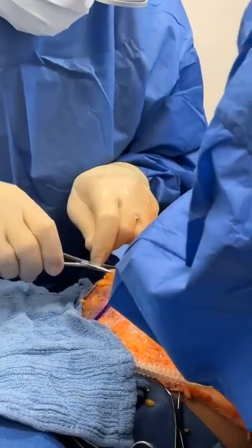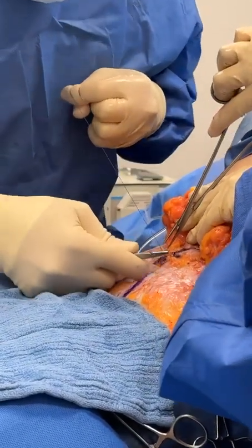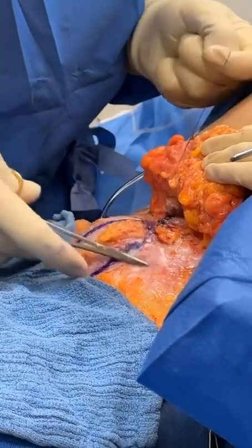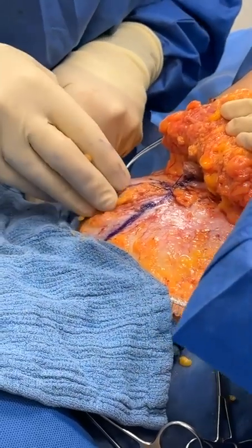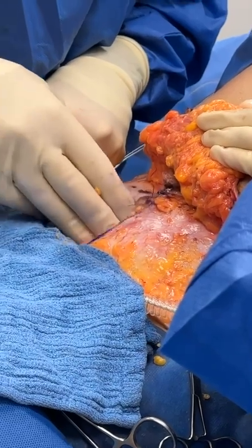And notice, that's what we're doing when we're doing the rectus plication, but notice how only one stitch. Yeah, only one stitch, right? And below the belly button, right? Because we already saw the ones above the belly button, but only one stitch. Look how much better it is. And then we're going to continue. And at the end of the day, we're going to show you how much better she's going to be.